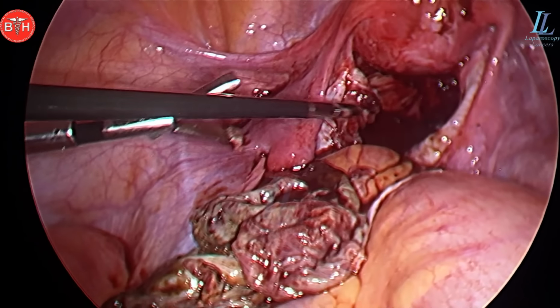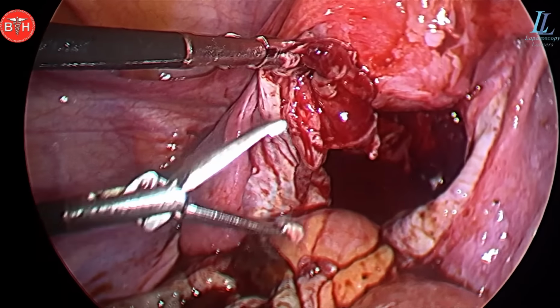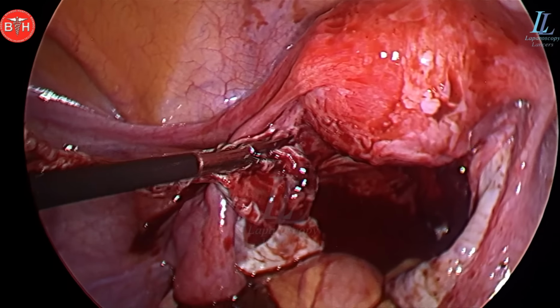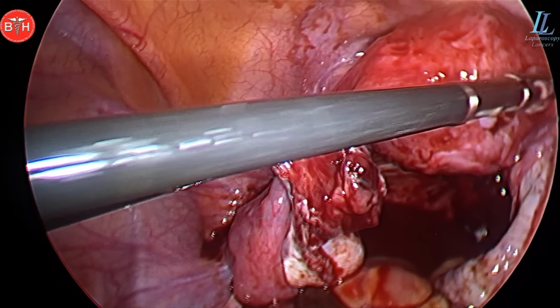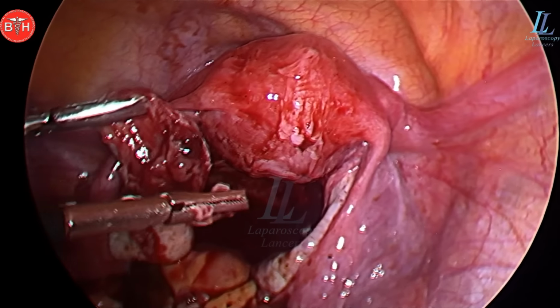All the chocolate cysts have been removed, nice and clear. There is no evidence of any hemorrhage. The thing that you are seeing, that's oozing, that will stop by itself. We have not given any Trenexa to the patient. There you can see as the blood is getting darker, that means the clotting has started. The patient has a normal bleeding time and clotting time.